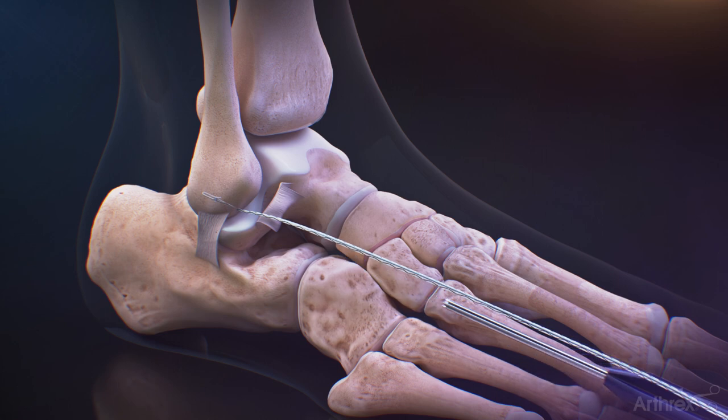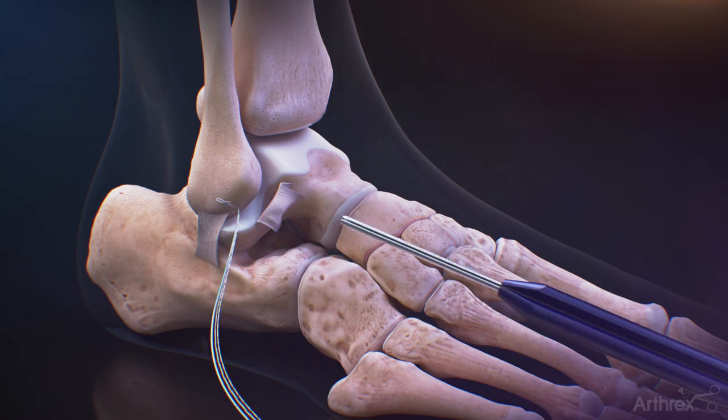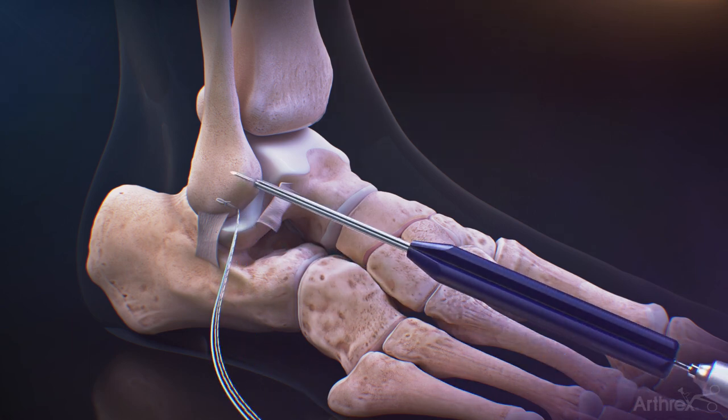Separate out the shuttle stitches from the blue working stitch, ensuring there are not any tangles or knots. Gently pull back on the blue working stitch, but only to make sure it is engaged in the bone. Do not fully set the anchor.